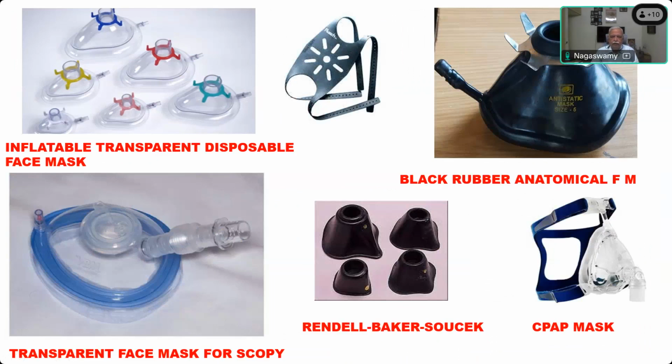In all Western countries, the UK, this is very commonly used. They will use this mask and allow the patient to breathe spontaneously with an inhalation agent. In the olden days, they would go for their coffee. A harness to hold the mask.